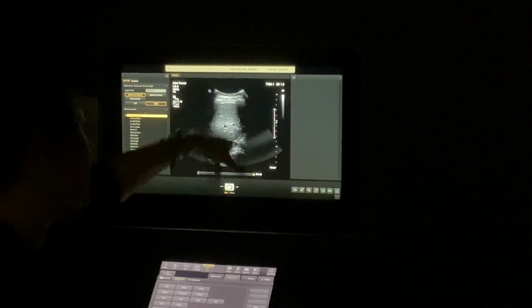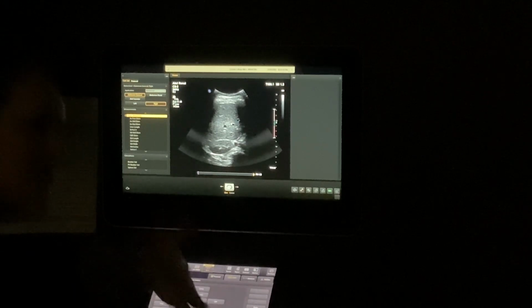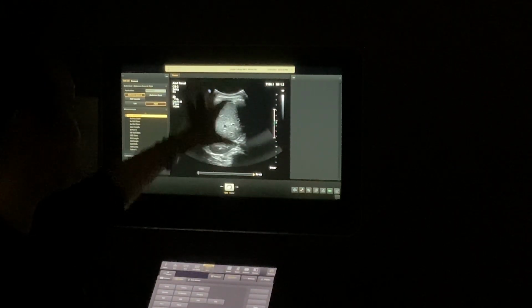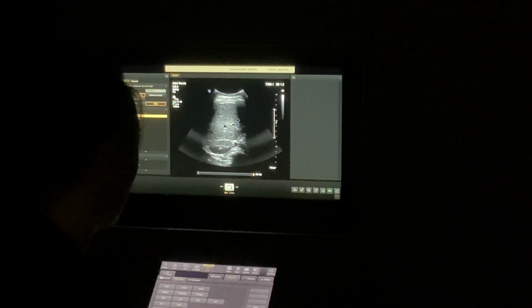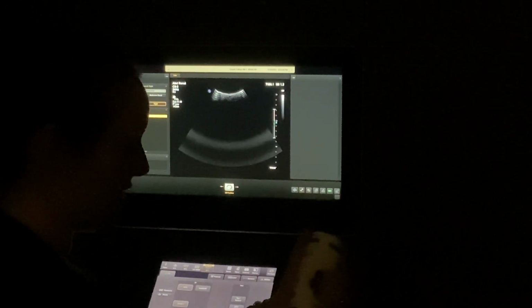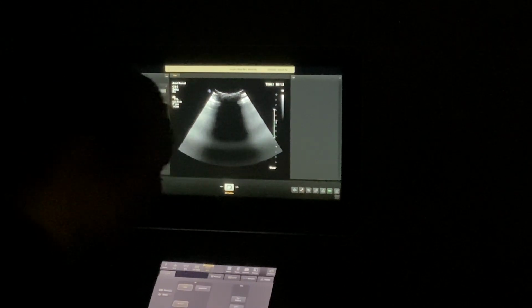I would count myself points off for this contact loss, so make sure you're putting the gel. But I came more forward, like a subcostal transverse liver approach, and came down through the liver using it as my window to make sure that kidney stood out nice and clear. Do y'all see how much clearer that looked than before? So that's the approach I want to take on her, okay? Found a new window when I turned on a different plane, and that will be necessary. I'm not saying find your window and then don't ever move. If the pictures aren't good, you're obviously gonna move.